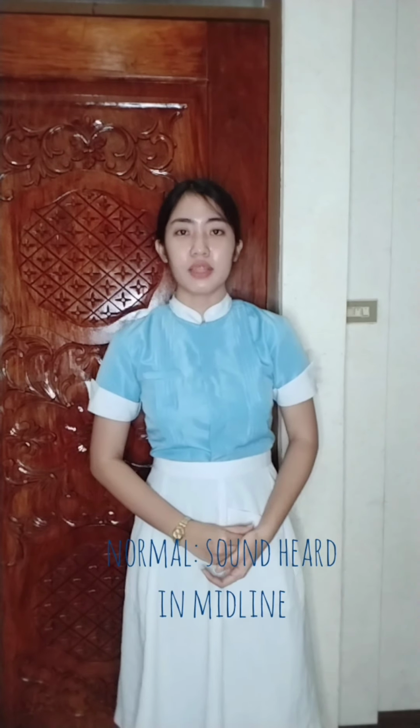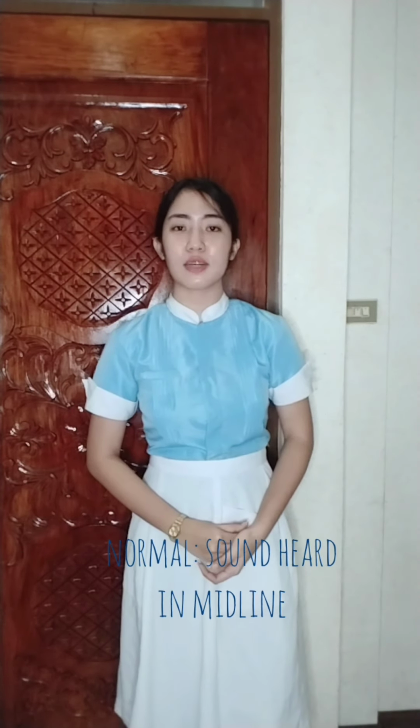And now for the results. The Weber's test is normal. The patient's hearing produces equal sounds in both ears, but if there is a conductive loss, it will cause the sound to be heard best in the abnormal ear, but if there is sensorineural loss, it will cause the sound to be heard best in the normal ear.